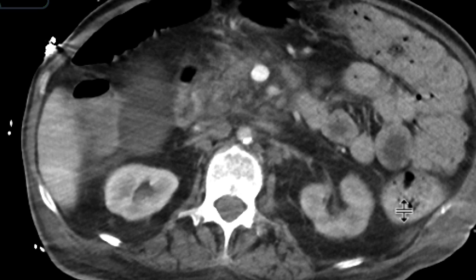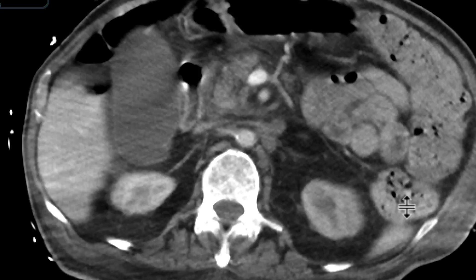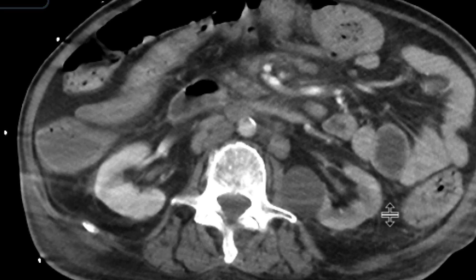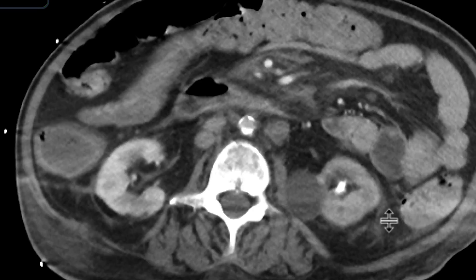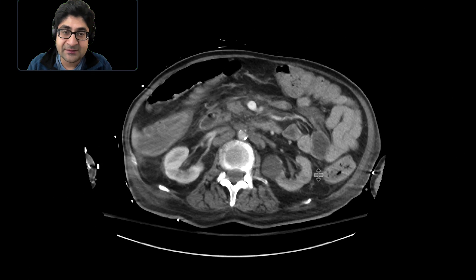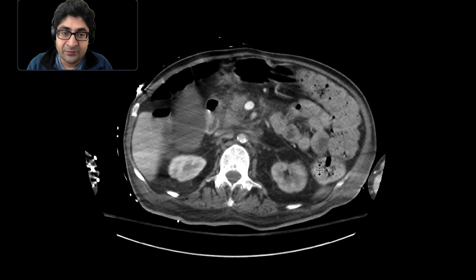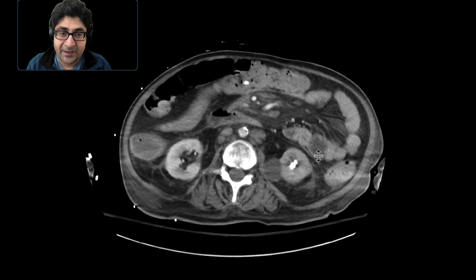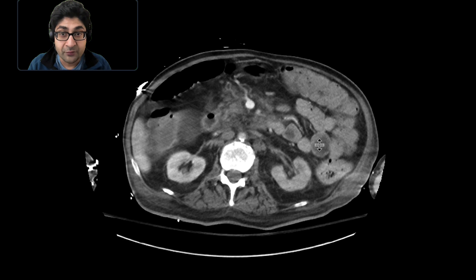More distally, you can start to see if there's some patency. These findings are highly concerning for significant narrowing of that left renal artery — probably highly stenotic, with only a tiny luminal opening allowing some contrast to get through to the left kidney. This is a nice example of left renal artery stenosis near-thrombosis resulting in diminished enhancement of the left kidney.